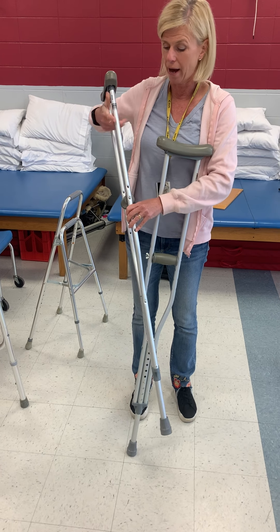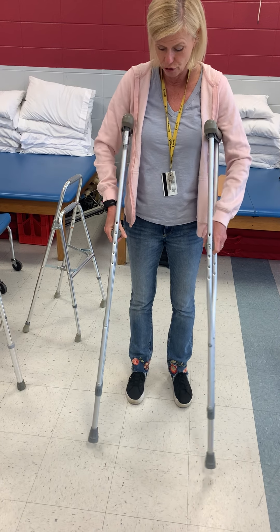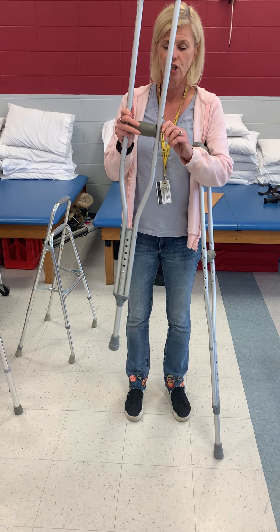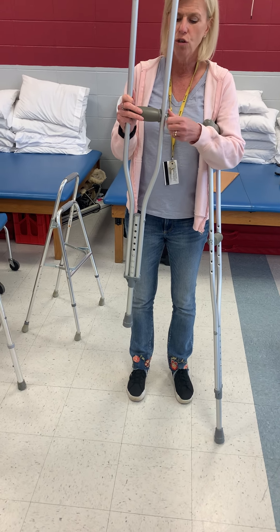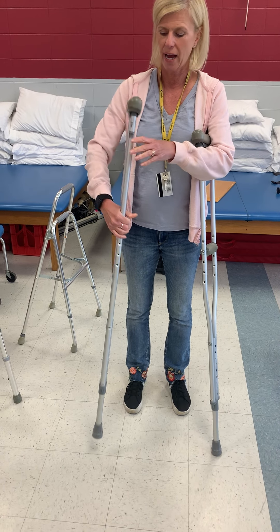Do not go by the heights printed on the assistive device — use your training. You can also adjust the hand grip. You want 20 degrees of elbow flexion at the hand grip.